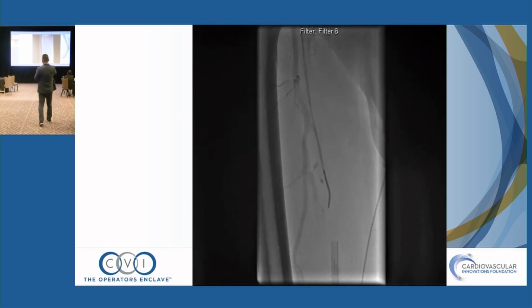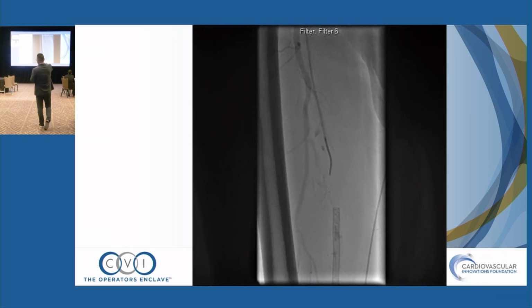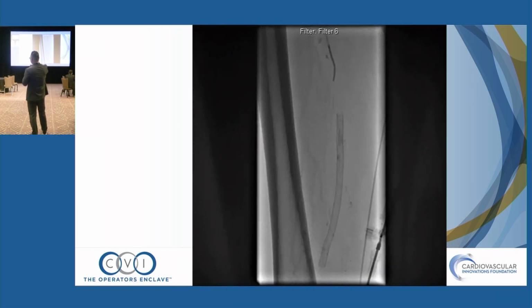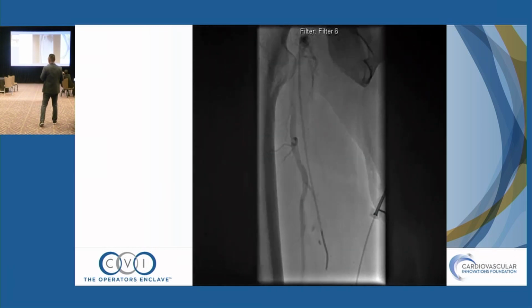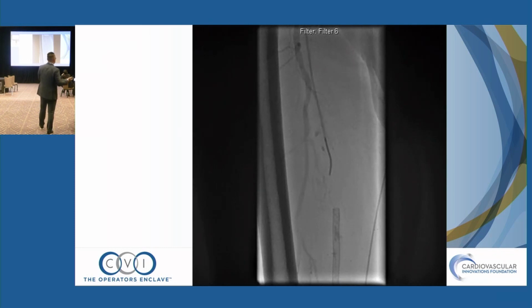We got down here, and exactly what Dr. Seamus said is what happened. I kept going behind the stent here. I don't show it, but it kept going behind. I could not just get into it. So what's the next step you would do potentially? What are my options?